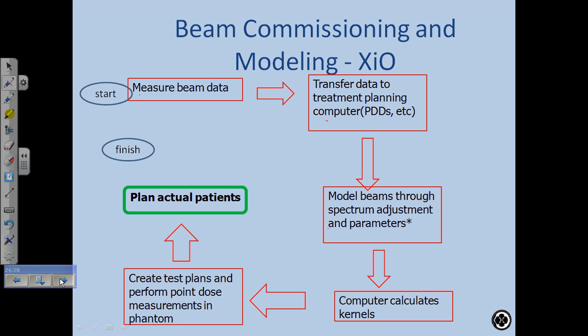Okay, then we create test plans and perform point dose measurements. Then we test everything, and then we plan actual patients, and we're done. Okay, so that's just the flow chart.